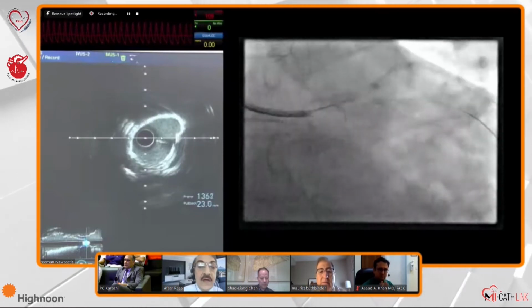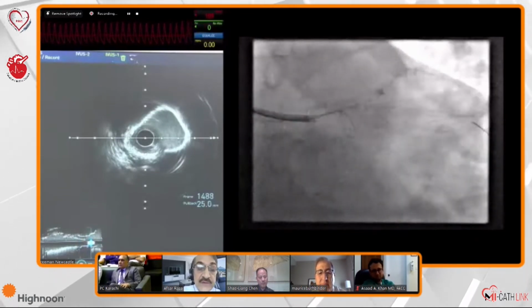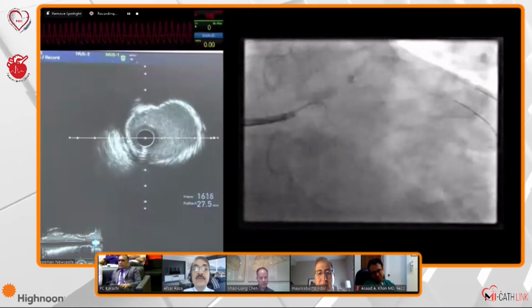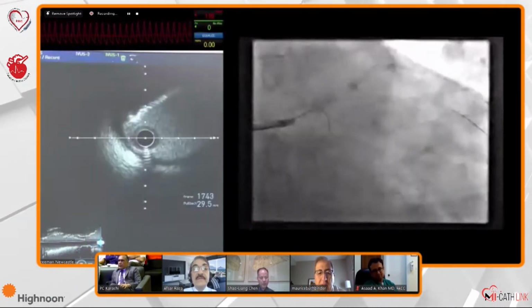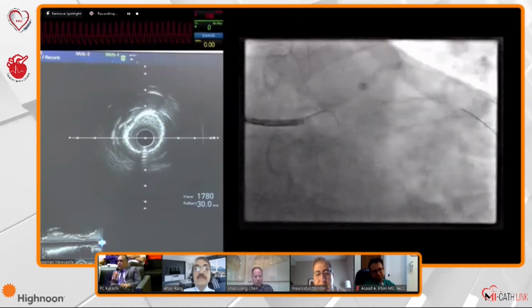Yeah, absolutely. So what is the MLA of this? Have you calculated the MLA? To be honest, I haven't. I was scrubbed, but it is less than 5 millimeters. Oh, for sure, at least distally. 3 to 5. Yeah, 3 to 4, definitely. Here we go. My question. Let's do the next one.